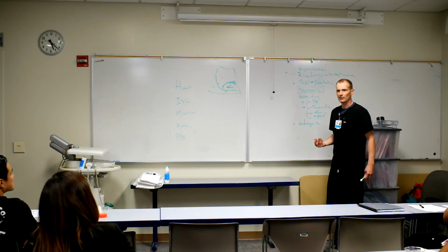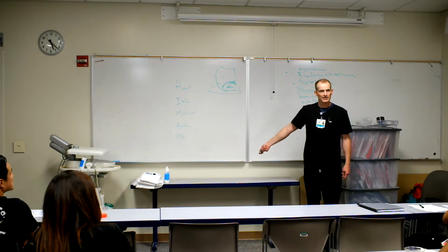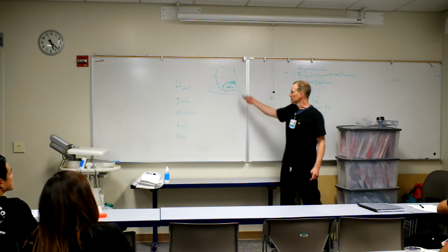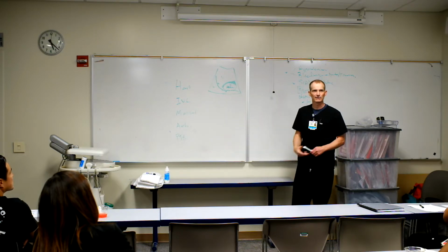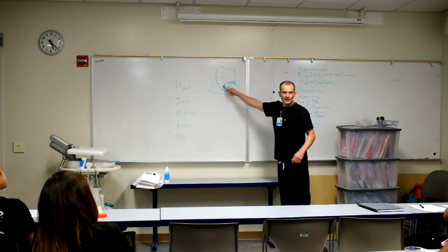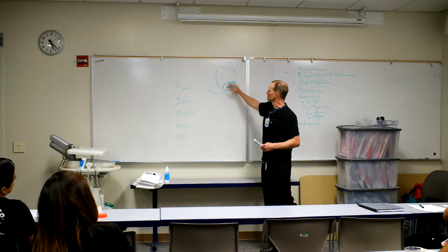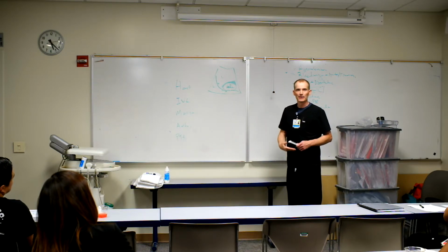Okay, and everyone couldn't figure out what the shock was, and to put the ultrasound on, I said, hey, there's clots all over his abdomen. Okay, so then they scanned him, and he had hemorrhagic ascites, and he went to IR, right? So black stuff in here, okay, because this is where it will collect. It'll either collect here first or in the pelvis, okay?